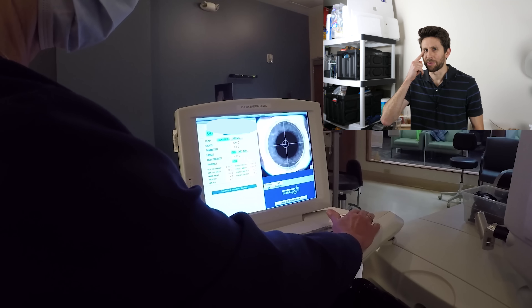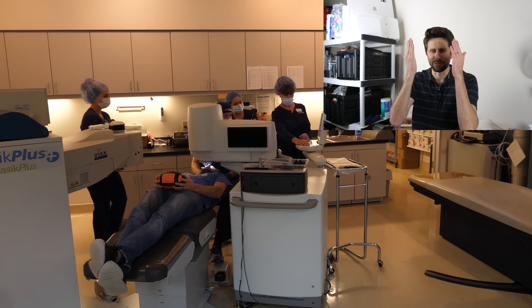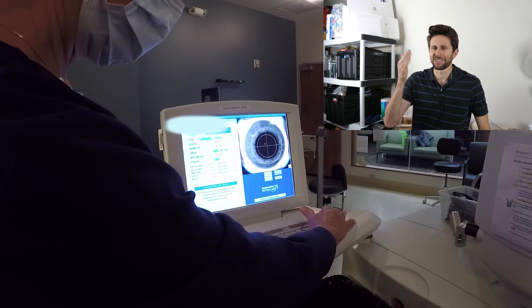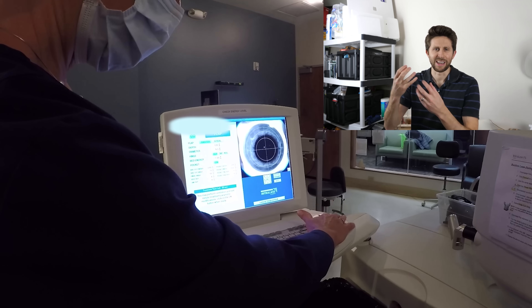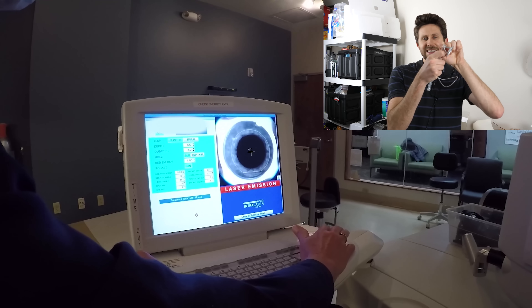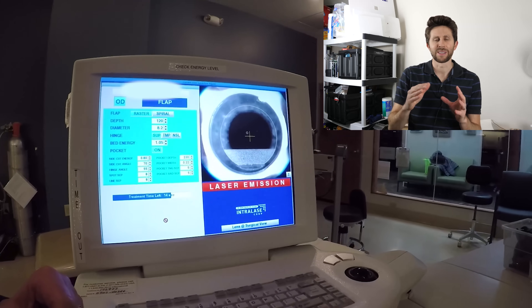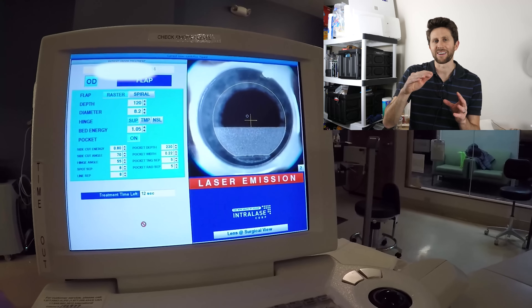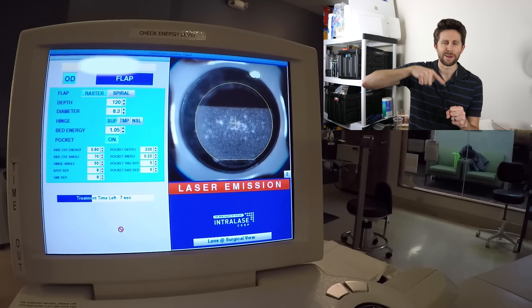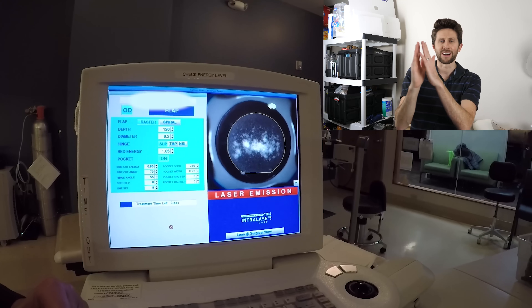You can actually mimic this if you just push on the side of your eye — eventually your vision will just black out, because you're cutting off circulation to your eye and it's not getting the blood flow it needs to create vision. Now they have these two pieces docked together with the lens squished up against my eye. You can see the laser form plasma underneath the thin layer of my cornea — it turns white as it forms, going up and down. You just see this white move across my pupil.